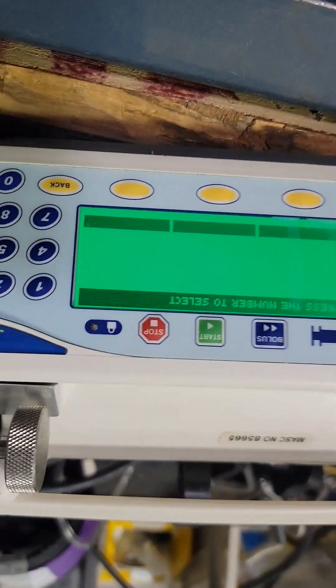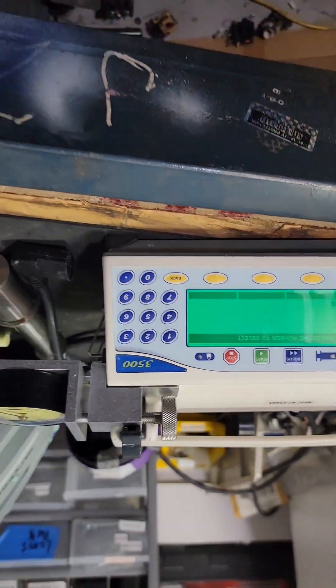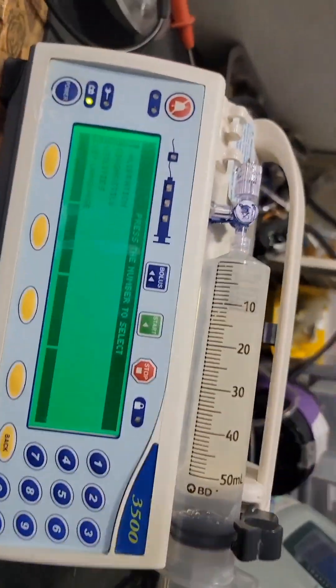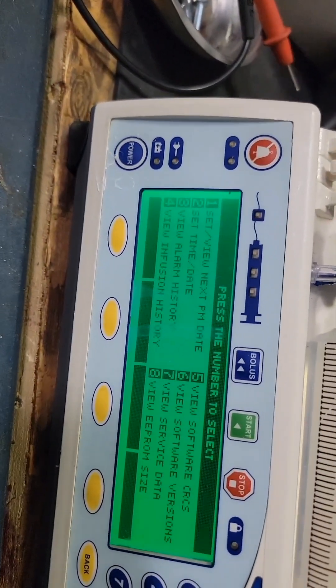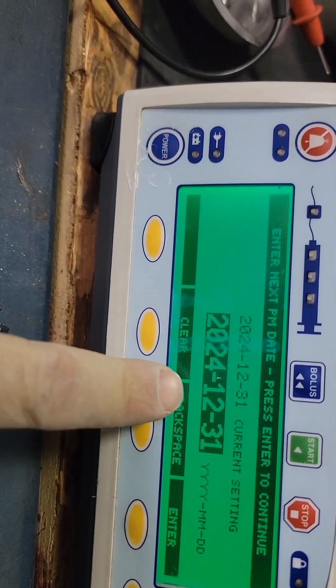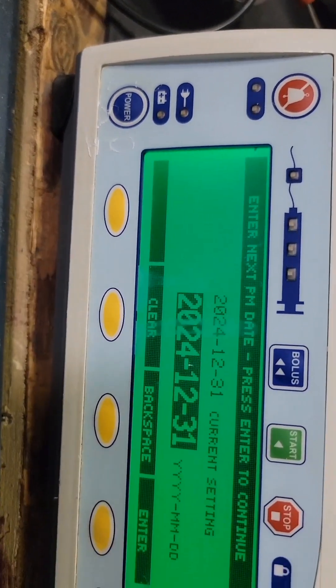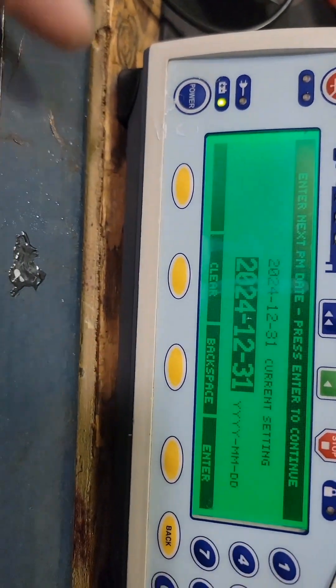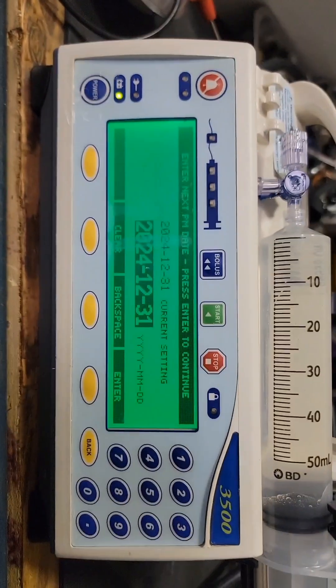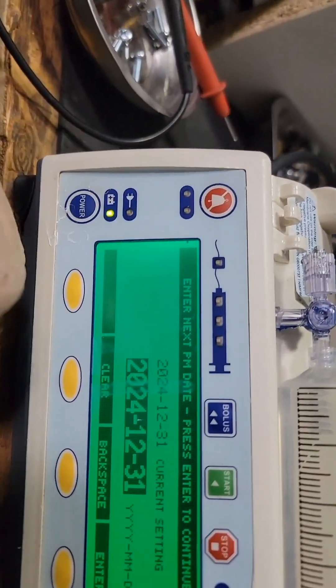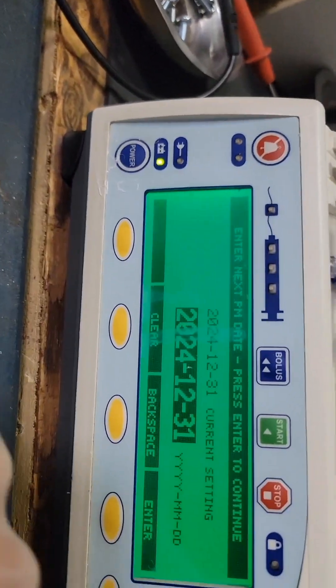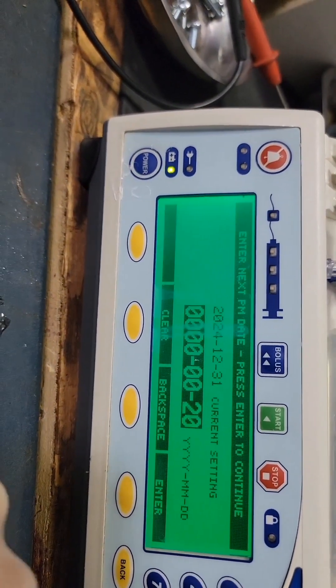When you're done with the PM you should go to utilities and make sure that is set for at least a year from now, otherwise it's going to alarm and ask for PM.